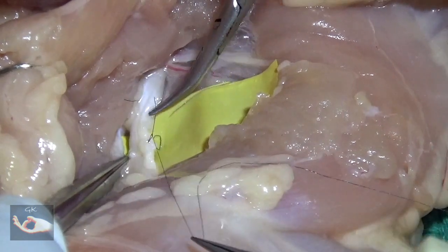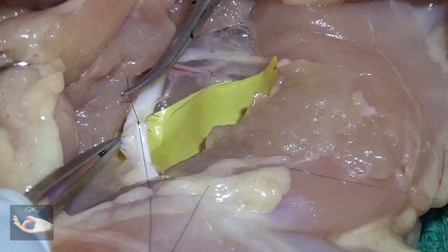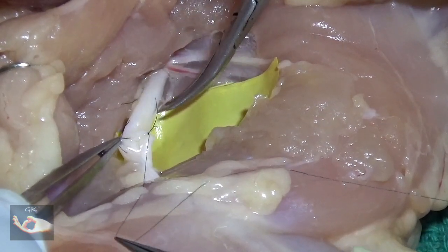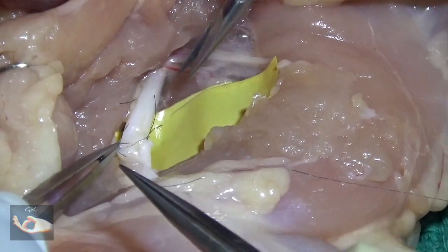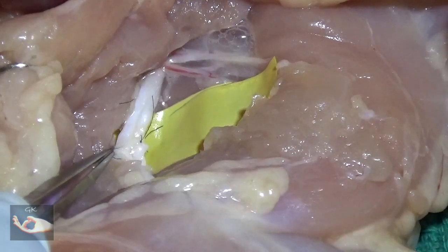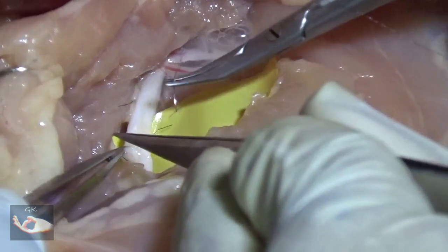You can now see the pouting of the fascicle that is just close to the knot being taken. That has to be dealt with by the technique described: take a stitch on the epineurium and push the fascicle inside while doing so.